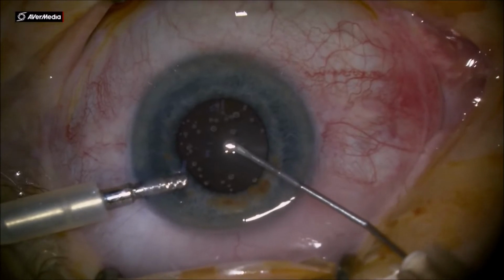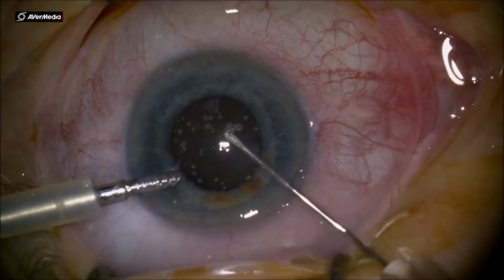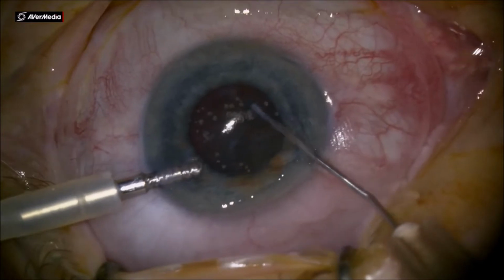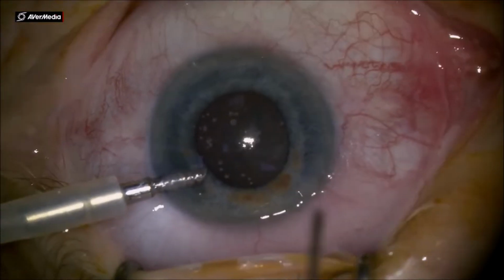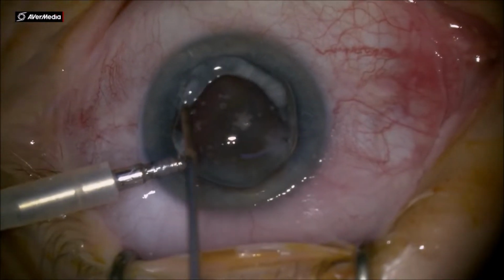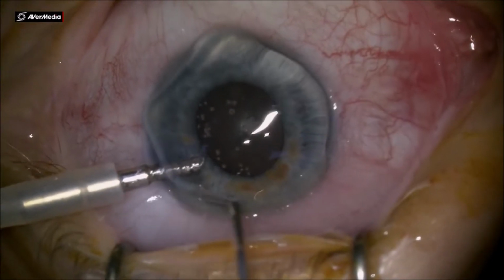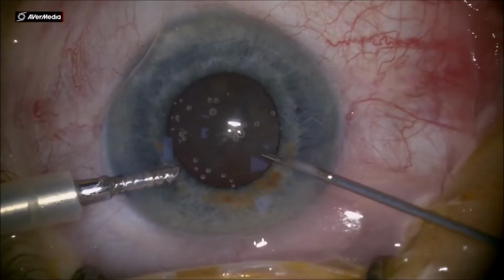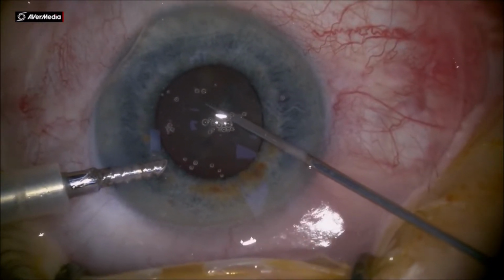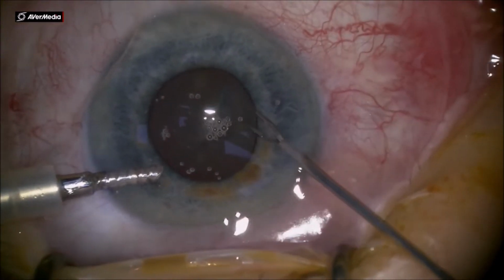and then with irrigation in one side port by AC maintainer, I use the cystotom to have an opening into the anterior capsule. It's very important to develop your skills and be able to do a capsulorhexis underneath the iris. When you have this kind of small pupils and leathery cataracts, hard cataracts, it's very important to have a large capsulorhexis.